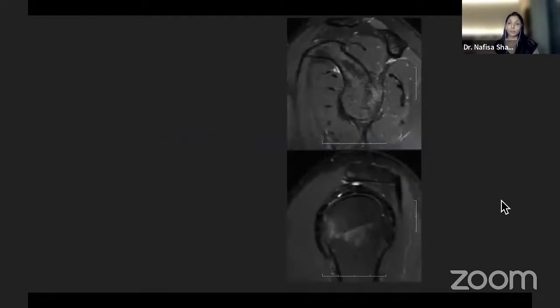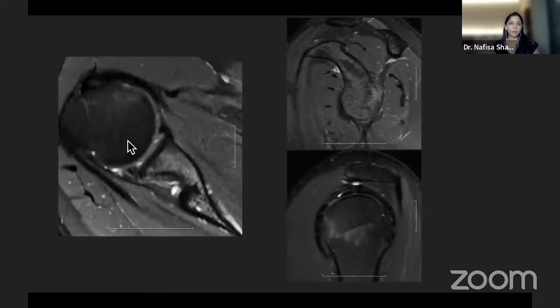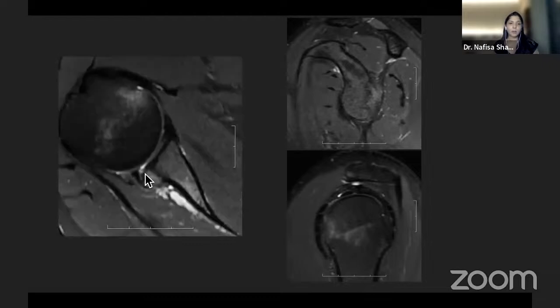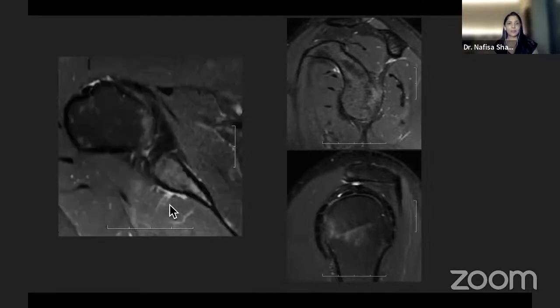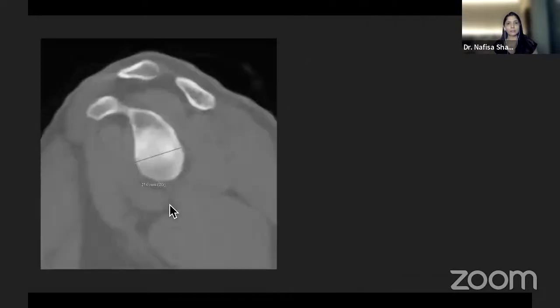Here's a 25-year-old footballer. He has a posterior dislocation, edema at the posterior glenoid, edema at the anterosuperior humeral head, which is the reverse Hill-Sachs lesion. There's just a small shallow defect here. And we also see a posterior labral tear. There was also some remodeling at the posterior cortex of the glenoid, telling us that this is a chronic injury.